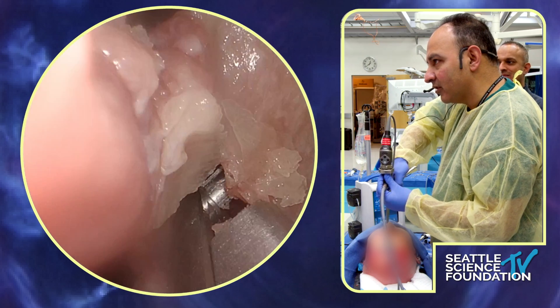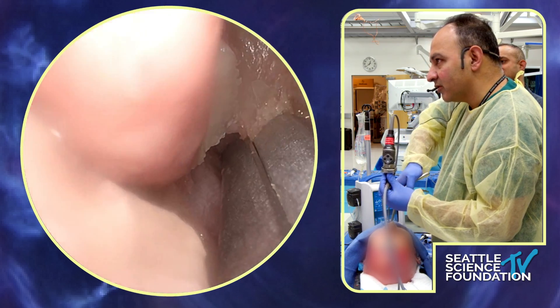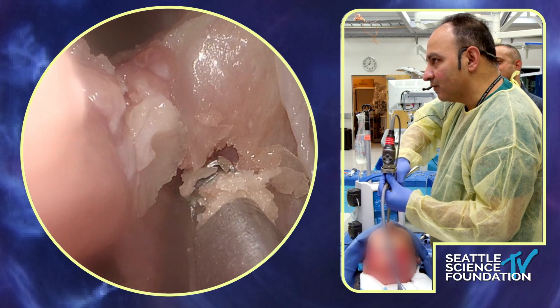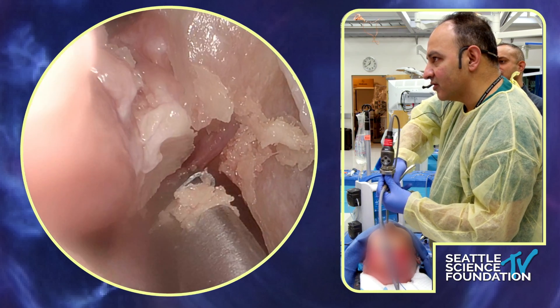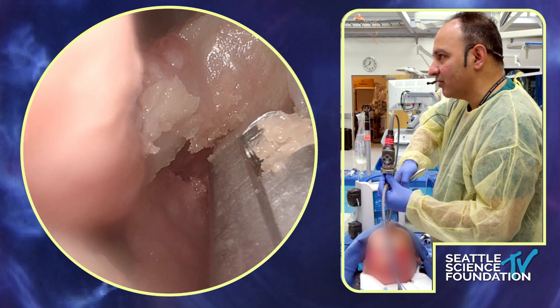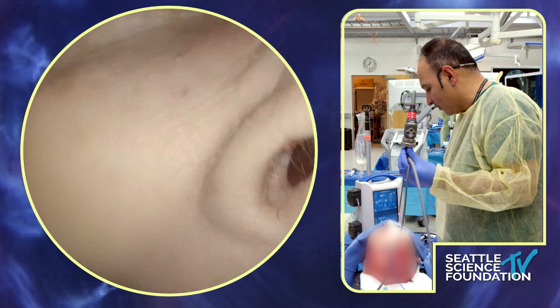If you just trace the artery here laterally with the kerrison, you can see you can just trace it out laterally. That's kind of fun. So to summarize: just come down there, find the artery, you'll find that crista, take that off, find the artery, and then you can trace it out laterally. Now let's talk about the anterior ethmoid artery.